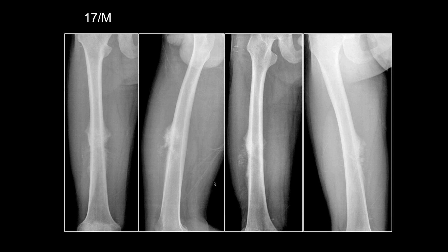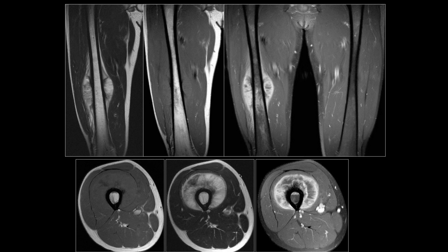Jennifer, 17-year-old male. So here we see some cloud-like matrix along the middle third of the femoral diaphysis. There's some periosteal reaction and some hair-on-end appearance here too. I'd be concerned about a malignant lesion such as osteosarcoma or Ewing sarcoma.